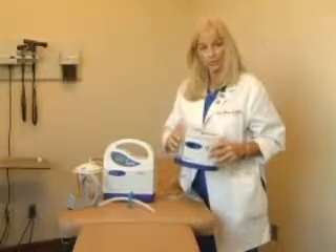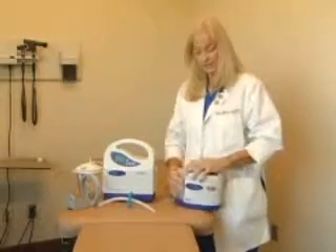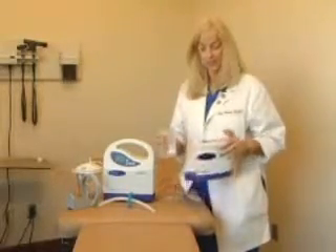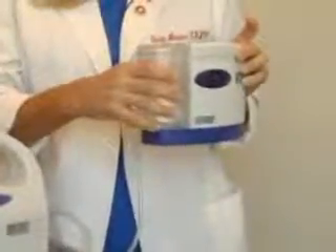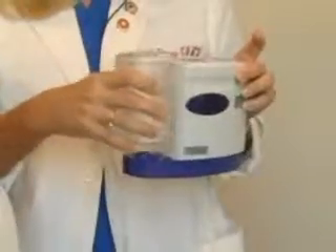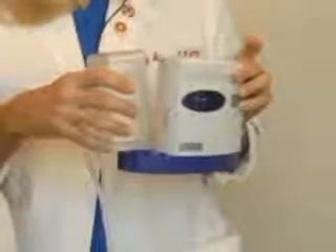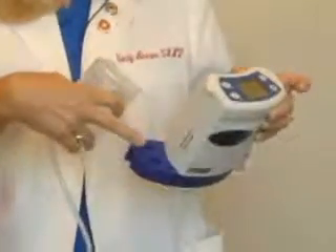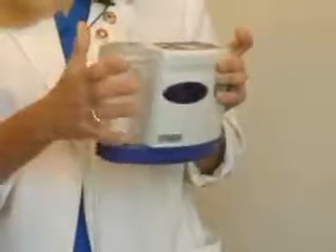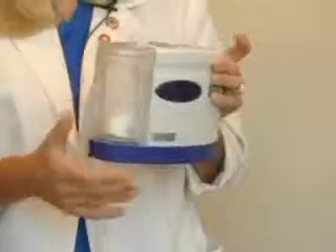The Pro 2 has a self-contained 250cc canister that easily slips off by clipping the tab on the top. Pull out straight — no rocking, no twisting — just pull out straight from the canister and the canister will disengage. The tracks on the bottom will help slide the canister in until you hear it click.